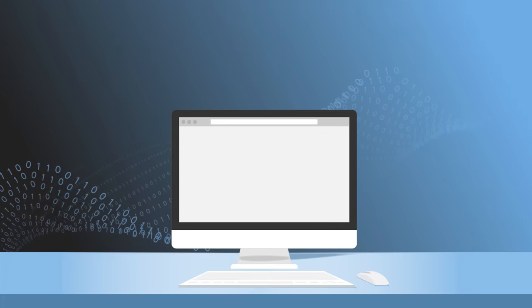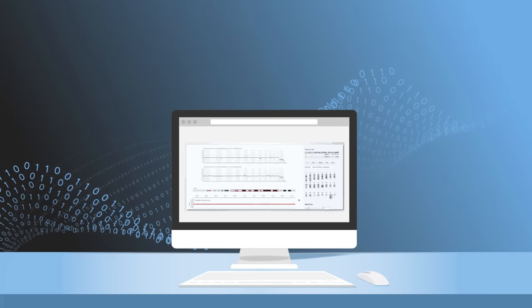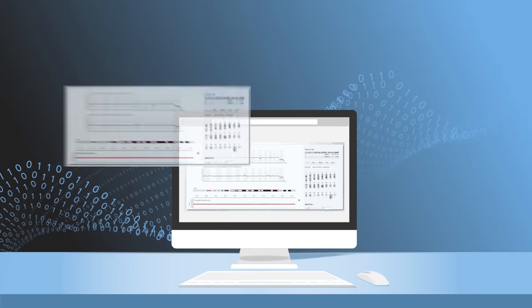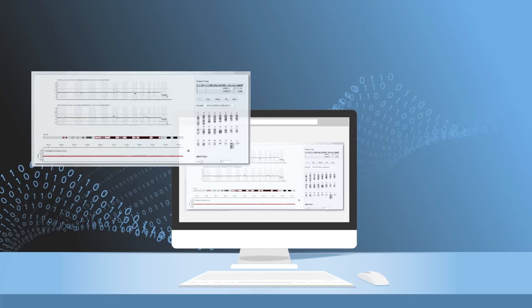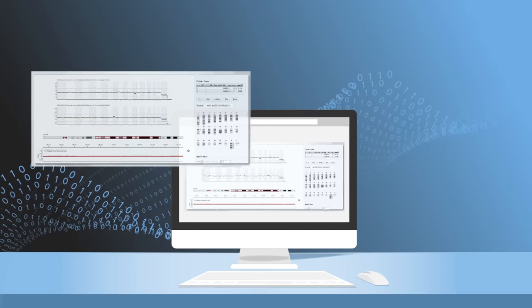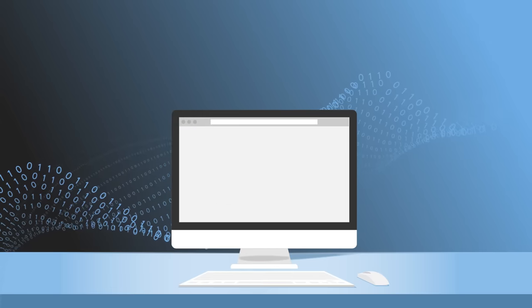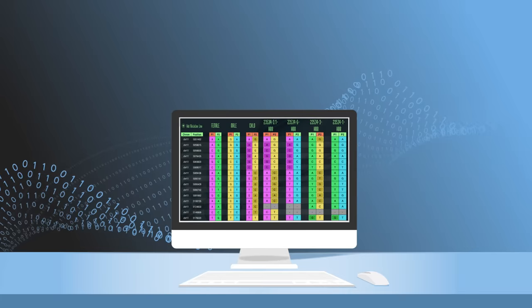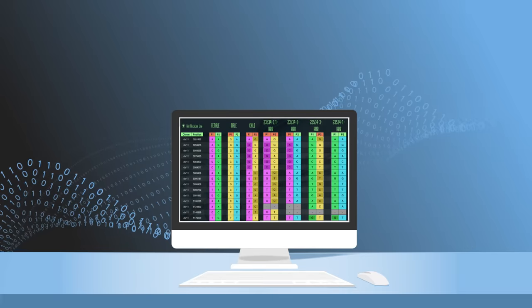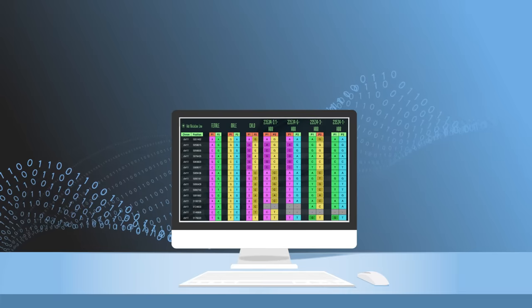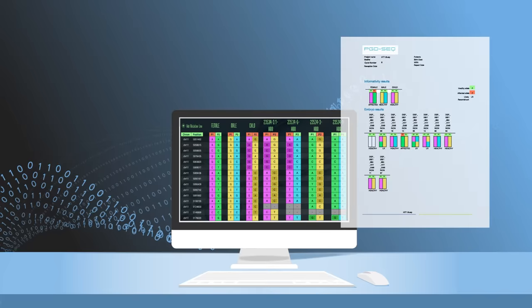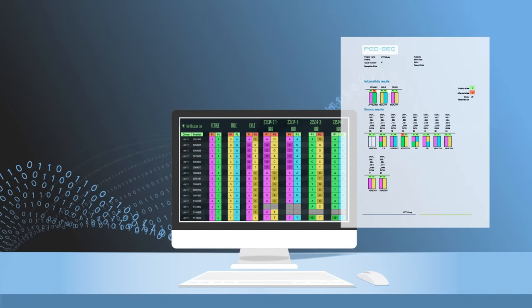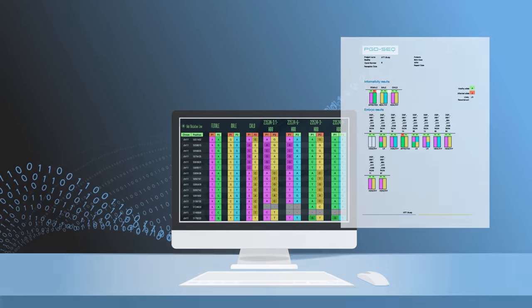The Repro-Seq PGTA sequencing investigates aneuploidies across all 22 autosomes and the X and Y chromosomes, which the system parses into a concise report. A simple reanalysis produces PGD-Seq PGTM data consisting of dozens of informative single nucleotide variants. Linkage analysis software then reports the reference alleles coming from each partner and relates these to the results of each embryo.